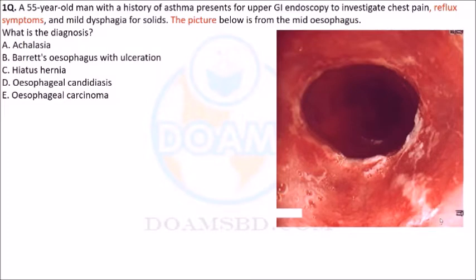Left side, if you can consider. I am moving the cursor here. So is it pink? Not pink, lightish, whitish, the white light color. So it is not pinkish. What is the reason of that? This natural color is not red. Why is this not red? This is the metaplastic change, like this gastric epithelium. But this one is not red. What is the reason?